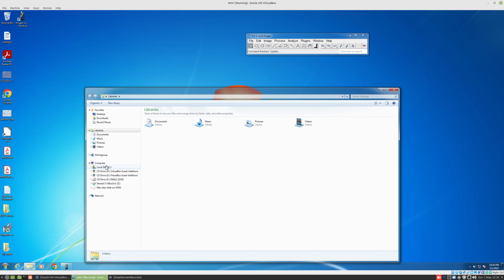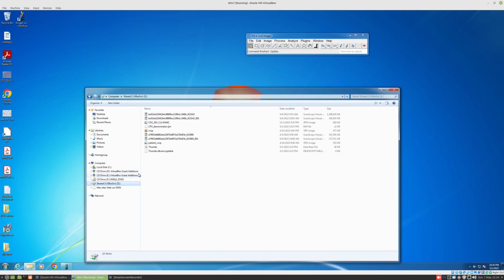Here we look under Share, and you see here this is the CPS Denominator.IJM, which means ImageJ macro. So you write, there are many ways to do that, but a simple way is to right click on your mouse and copy this piece of software.